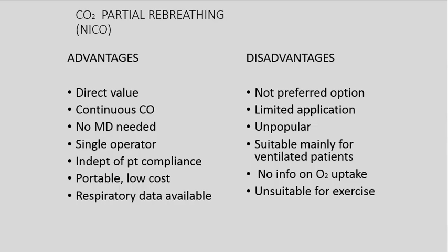The advantages and disadvantages of the carbon dioxide partial rebreathing. It gives you a direct value. It's a continuous cardiac output monitor. It doesn't require a doctor once it's plugged in. It's a single operator use, independent of patient compliance. It's portable and it's low cost, and you get additional valuable respiratory information.